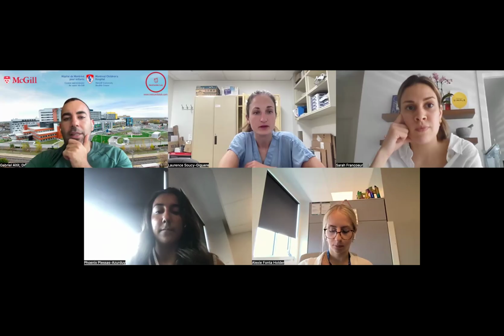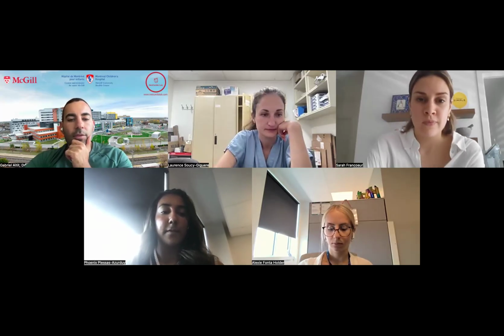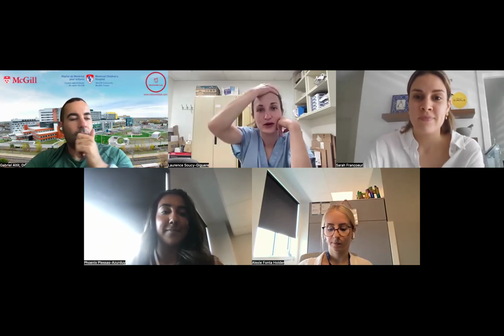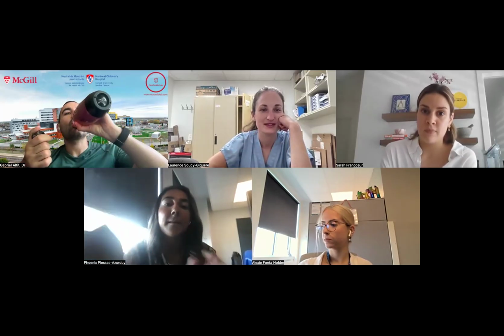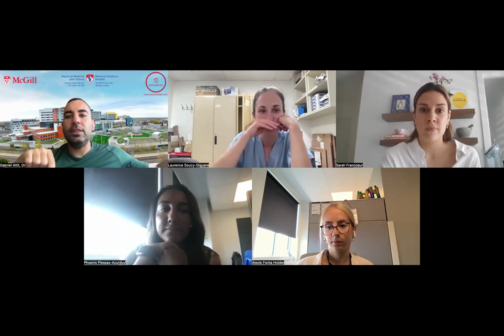Okay, any questions based on all of this? No, I think it's going to come up when I actually scan. Yeah, we're going to be doing scans and we're going to see the different options.